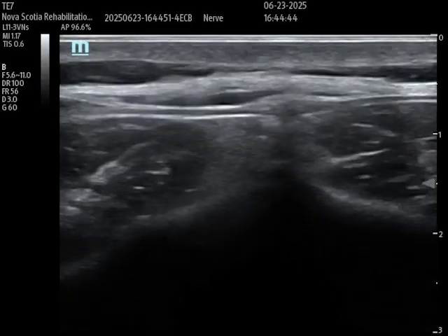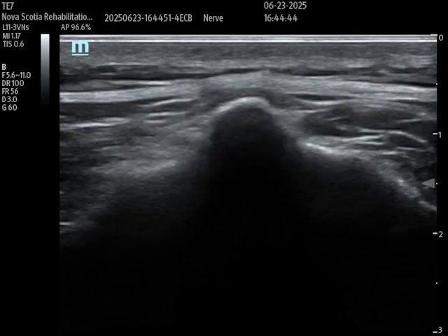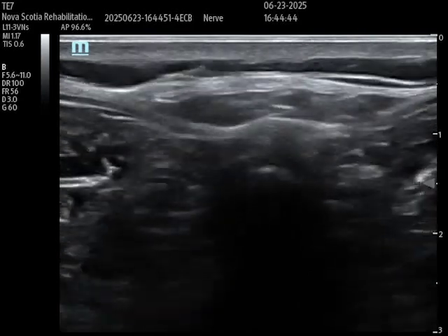Here we have the ultrasound in transverse plane over the back, and I've identified the spinous process of the lumbar vertebrae — you see that nice hyperechoic bony landmark with that posterior acoustic shadowing. What I'm going to do next is take that ultrasound probe and translate it distally, keeping it in the midline.